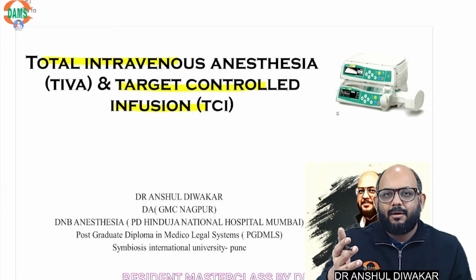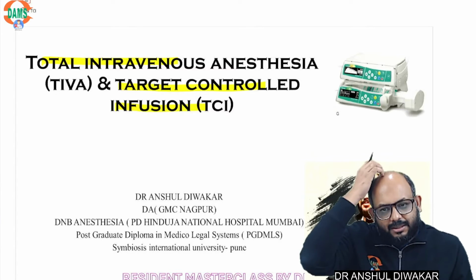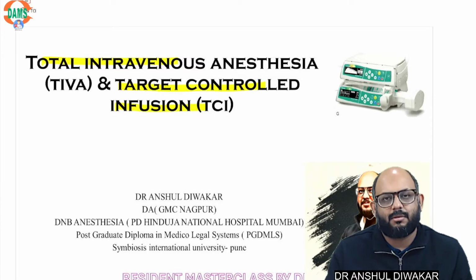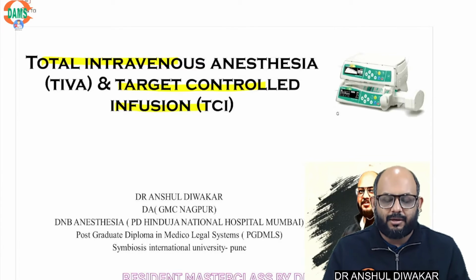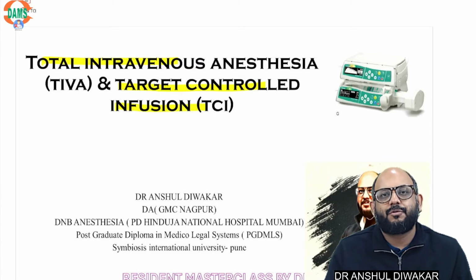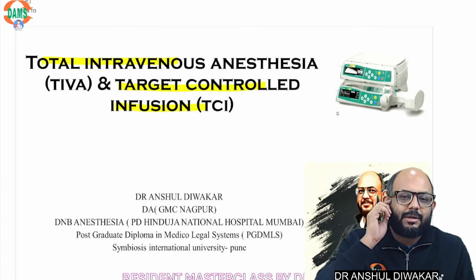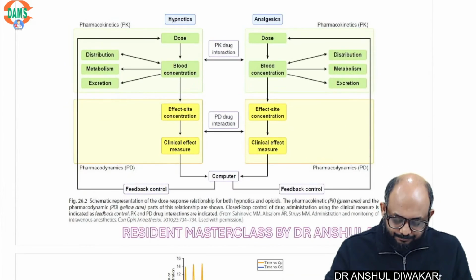And you know what? When you are working as an anesthetist in India, then TIVA is often the term that is miscoined by the surgeons and even a lot of anesthetists when they are doing some case in sedation. So when you do something in sedation, the technical term for that is monitored anesthesia care. That is when you don't do airway management, but you maintain a light level of sedation in which most of the local procedures can be done. But then you normally call it TIVA. Why? Because you are not giving inhaled anesthetic agent, but you only call it TIVA when there is total intravenous anesthesia, that is for the purpose of surgery.